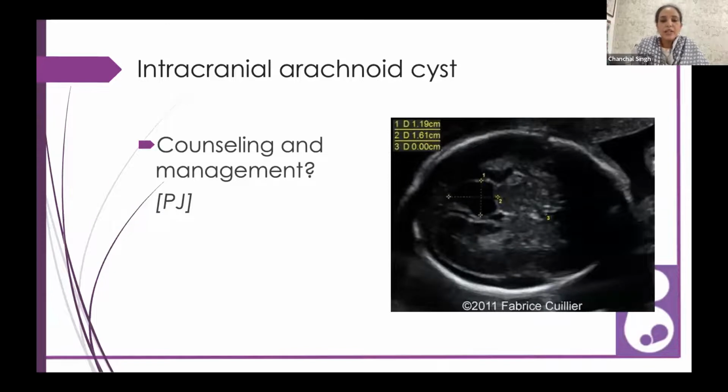Now, Dr. Prashant, I did not have a case of an intracranial arachnoid cyst, so I've just taken it from the net. It's uncommon, but occasionally one would come across a finding of an intracranial arachnoid cyst. On our part, we would scan and make sure that the rest of the structures are normal. Dr. Prashant, you being a pediatric neurologist, I would want your opinion on how you counsel these patients and what postnatal management the parents should be told.